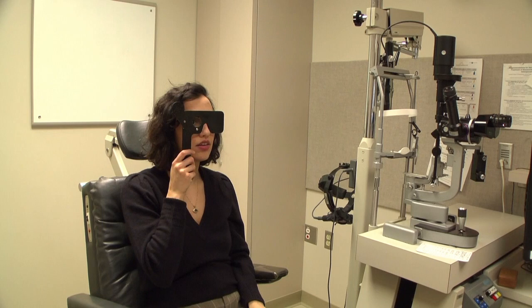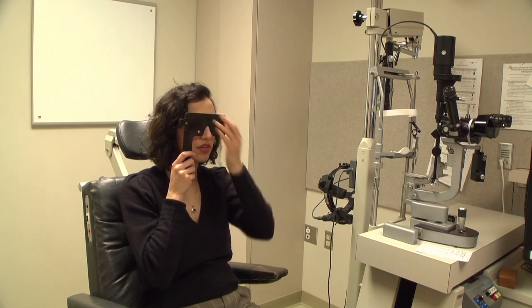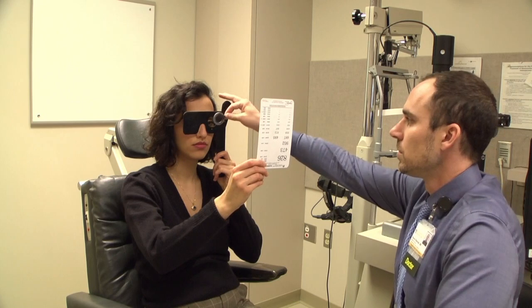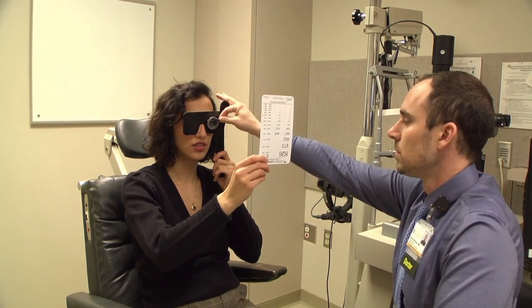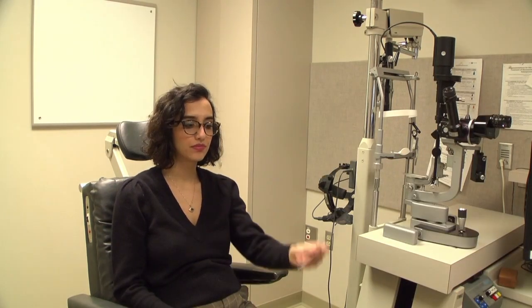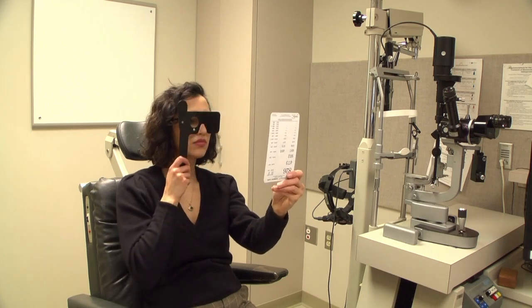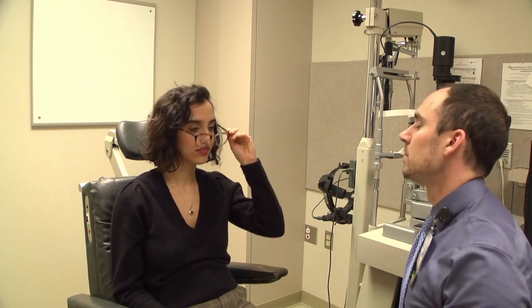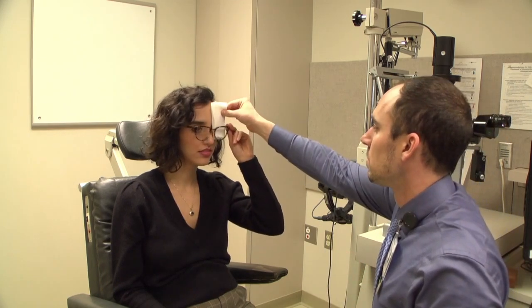If the patient is unable to read the 20/20 line, check vision again with the pinhole. If the vision improves, this would indicate the possible presence of refractive error. You may need to hold up a loose lens, such as a +2 diopter lens, for checking near vision if a patient is presbyopic and does not have their reading correction. Use a near card held at a comfortable distance and check each eye as you did with distance vision. If an occluder is unavailable, for example, in the inpatient setting, you can always substitute a piece of tissue paper.